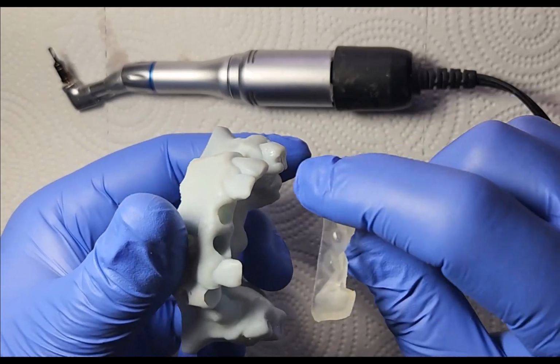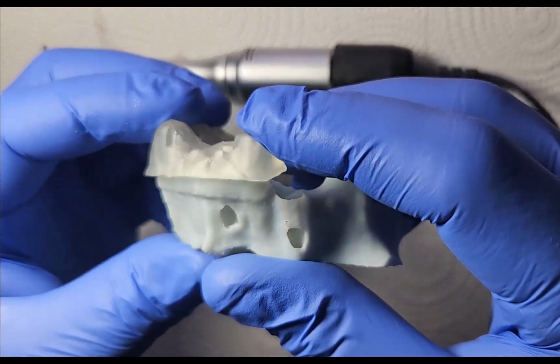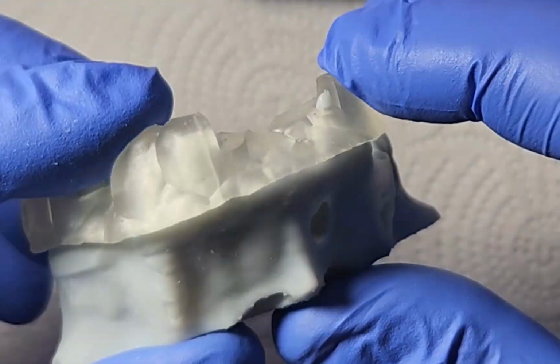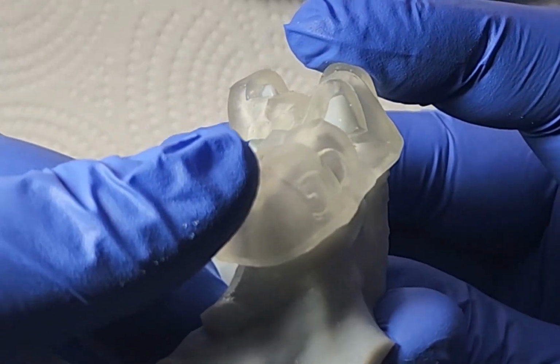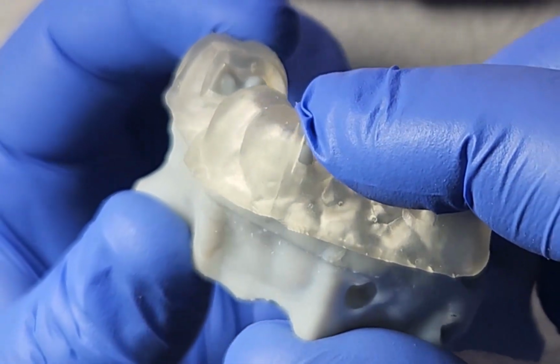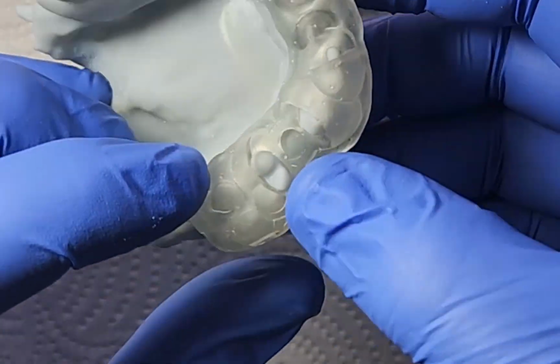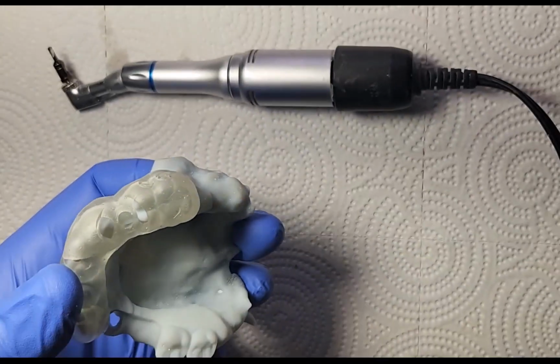But the first thing you always want to do is verify the fit of your surgical guide. And so when I seat that completely, you can see in this window right here that those cusp tips are fully indexed. We should also see it right here. Everything is completely seated and the guide's fully engaged. And so with that, we would be ready to go ahead and do our drilling protocol.